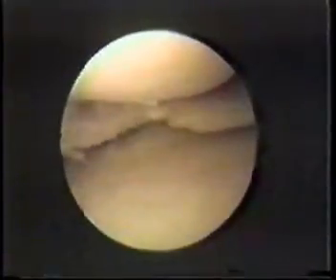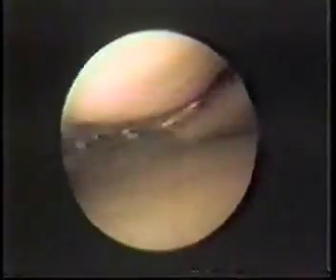And there's a very funny configuration of the posterior horn of the medial meniscus that looks like there's a loose tag of meniscus located near the notch, which is going into the notch, almost like the bucket handle tear that I showed you before. Now, to get a feel for how arthroscopy sees things, I'd like to show this patient had a repeat arthroscopy, and right at the tip of the probe there is going to be a big hunk of meniscus, which is a big tag, which is pretty much free. See how it moves?